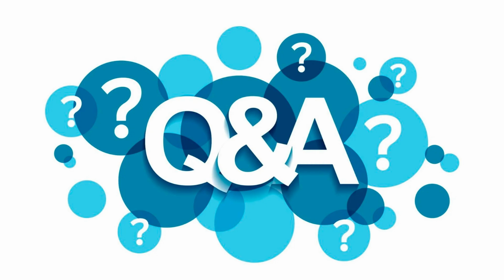Okay, we've got one. I just came from a workshop. Actually, you already answered that, correct? Yes. I just came from a workshop on reading. Okay. We've got one that came in.